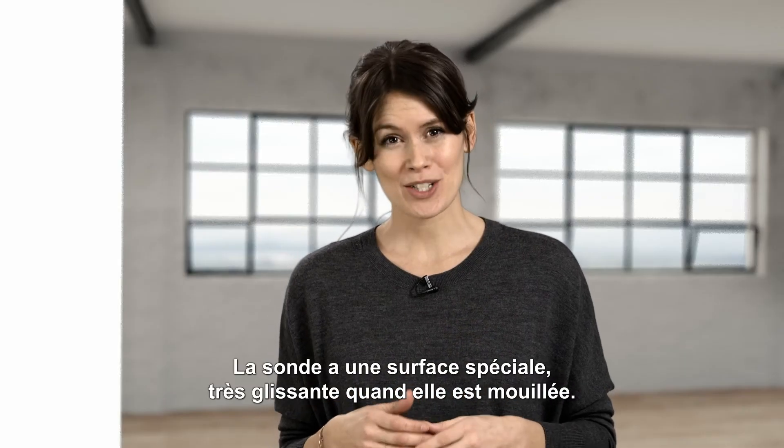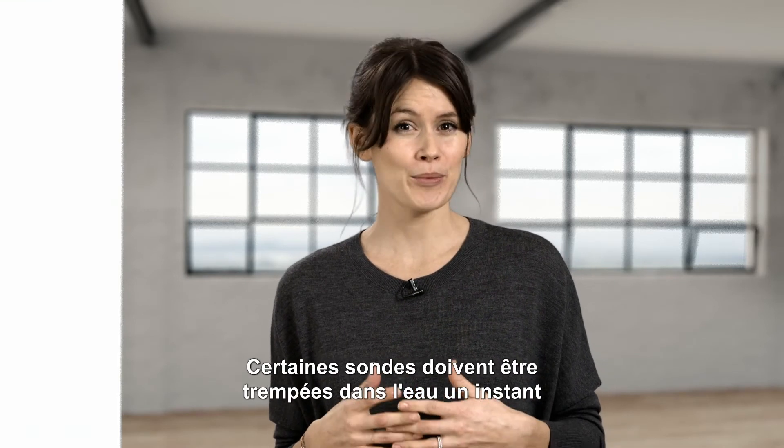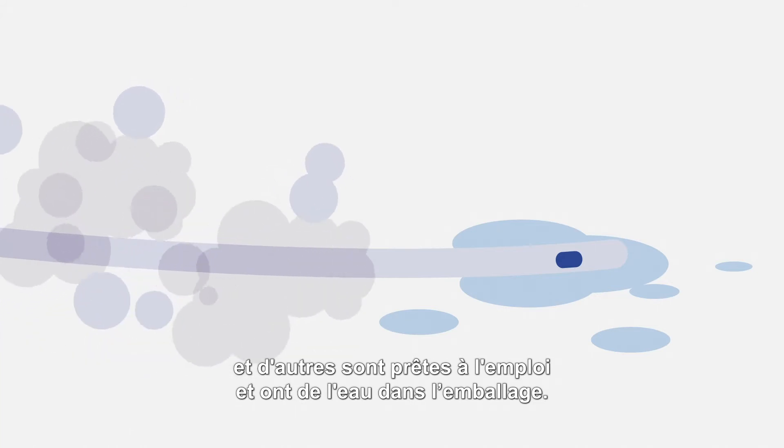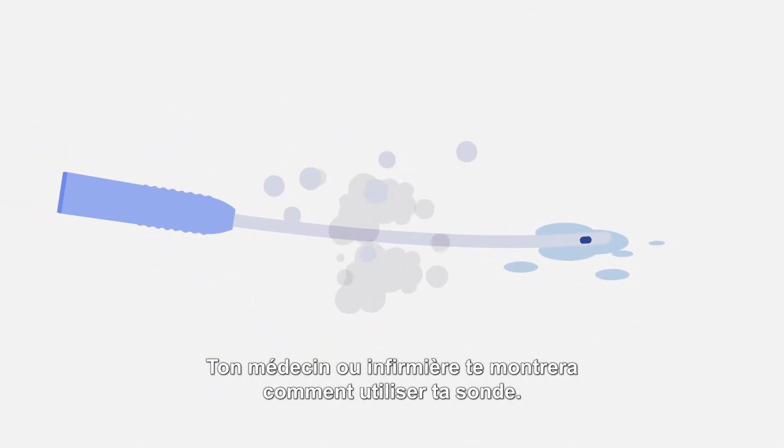The catheter has a special surface that gets very slippery when it gets wet. Some catheters need to soak in water for a short while, and some are ready to use and have water already in the package. Your doctor or your nurse will show you how your catheter works.